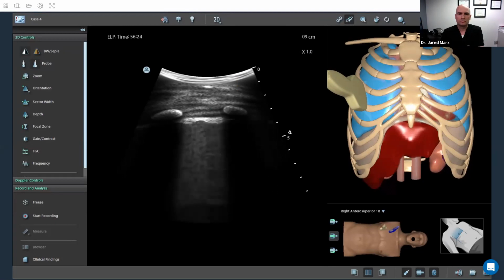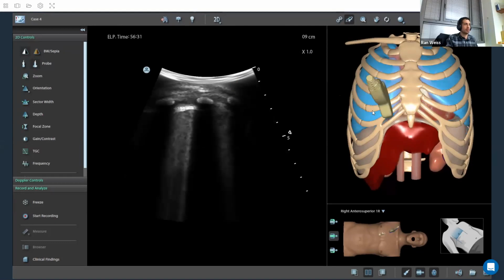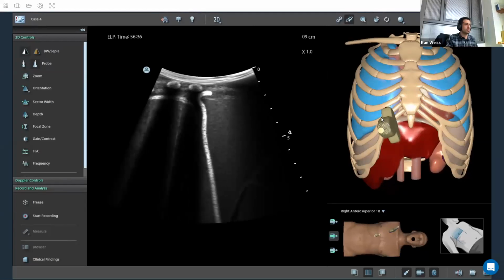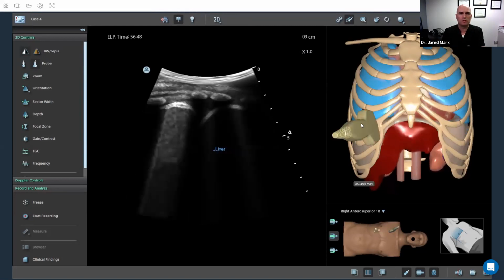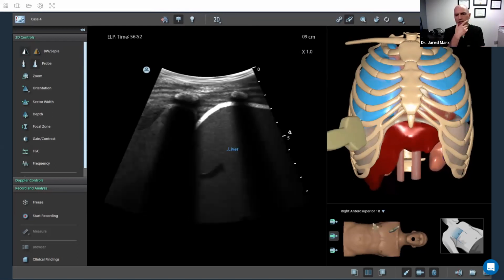And then maybe just show them a diagram. Yeah, sure. So in COVID, especially, not that we're doing education on COVID, but they don't typically have very large pleural effusions, if they have them at all. And so we can see an example between these ribs that there is a little black space, which may represent a very mild case of an effusion, which would be typical of our COVID patients that we're taking care of.